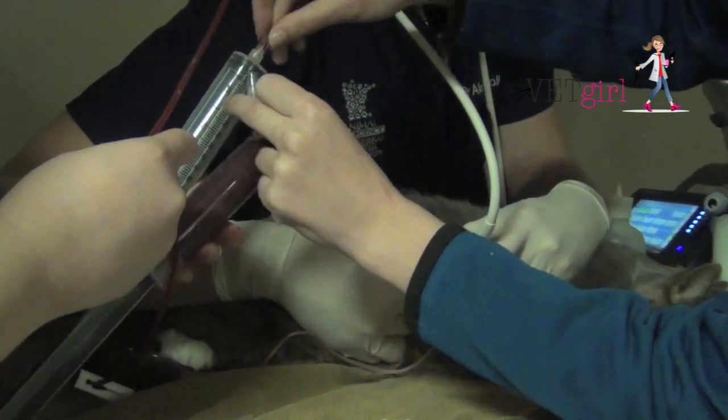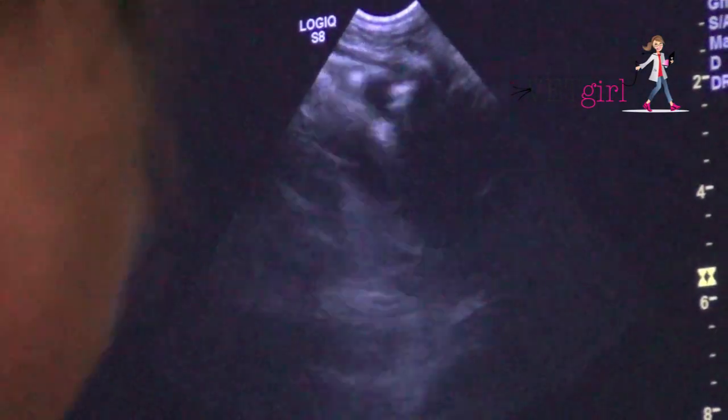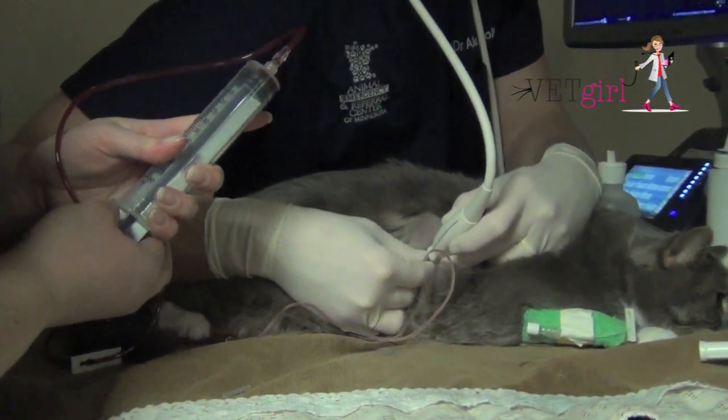On repeat FAST ultrasound, we can see there's a dramatic improvement in the reduction of pleural effusion. And if you don't have a FAST ultrasound, still go ahead and do a thoracocentesis — it can be life-saving in that dyspneic cat.